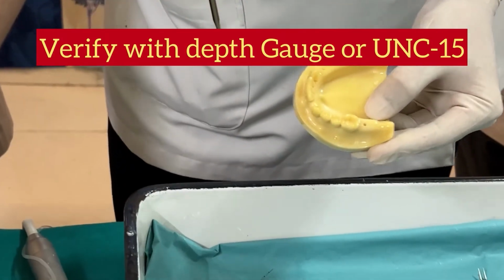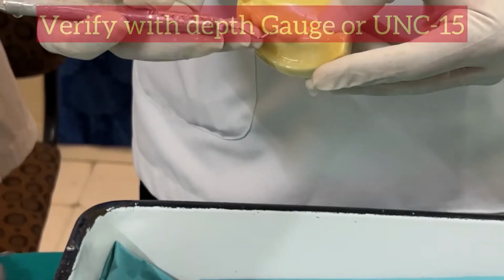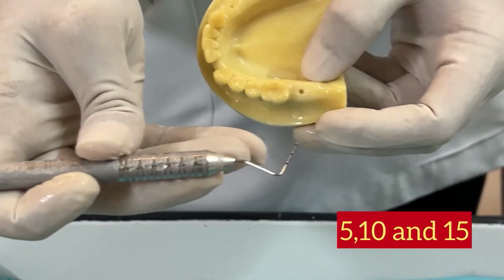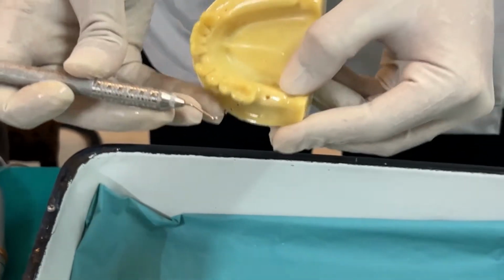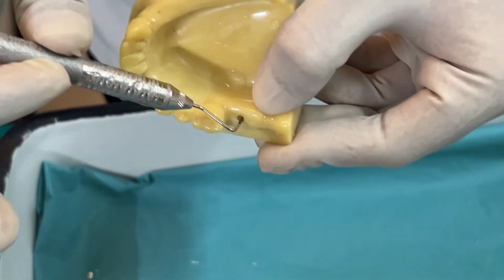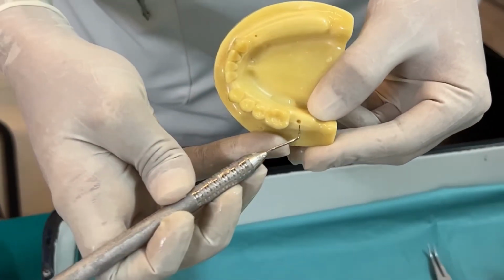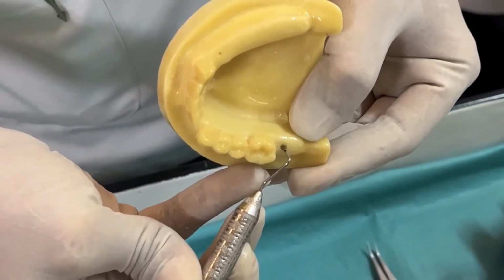But we have a very good periodontal instrument, the UNC 15 probe, the University of North Carolina periodontal probe. This has markings at 5, 10 and 15. The black bands at 5, 10 and 15, otherwise markings at 1 millimeter intervals from 1 to 15. So straight away you can verify the depth with UNC 15. This is one instrument which I would definitely recommend. Always and always use UNC 15. What you are seeing is at least the 10 mm mark is inside for your 11.5 millimeter implant.